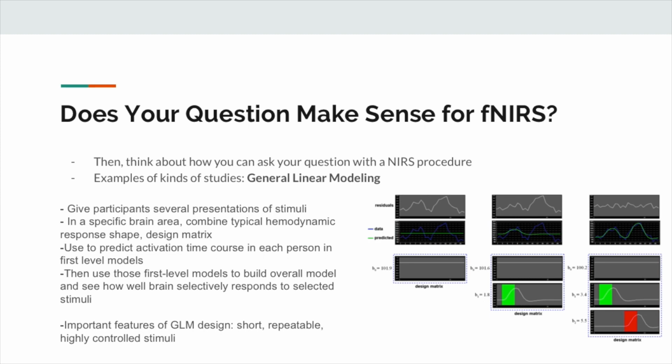There could be situations that you care about where you don't know the specific process going on. You can't really isolate the very particular thing going on in this area of the brain. And so if you're trying to run a GLM based on that, you could have a hard time just by not defining your hypothesis really, really well.